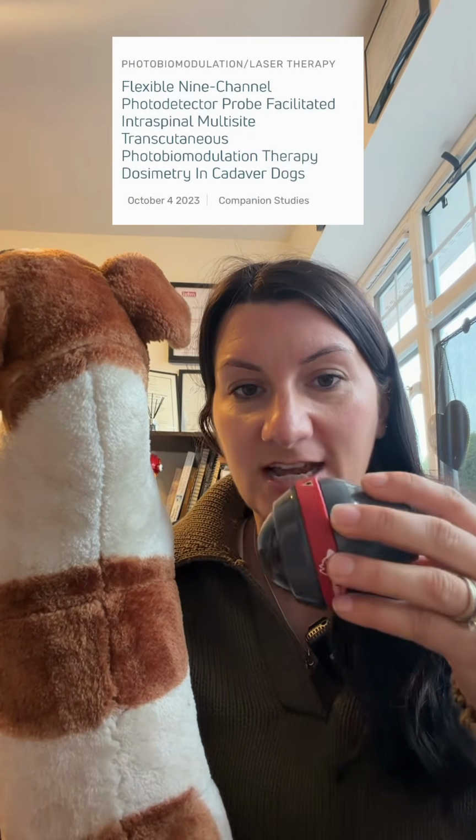So when it comes to then application, we've looked at contact and off contact treatment in the past, and we know based off studies again that using contact treatment, particularly with the spine, is most effective and will get up to 67% more light reach that spinal cord as a result. So contact treatment wherever possible. Then how we're actually going to apply it really matters.